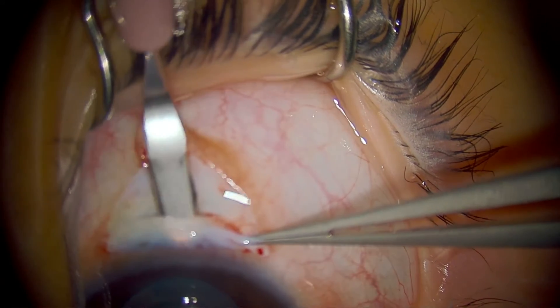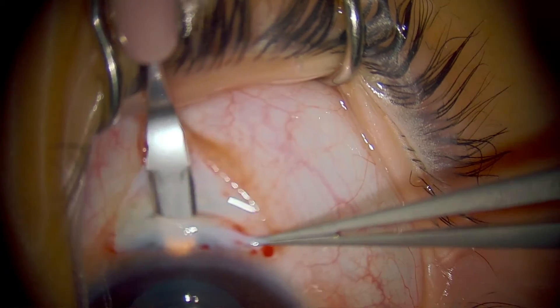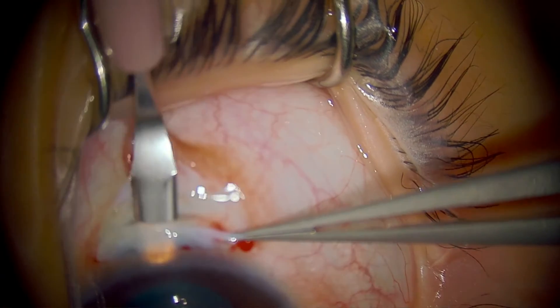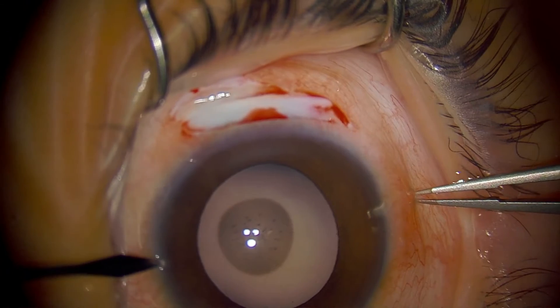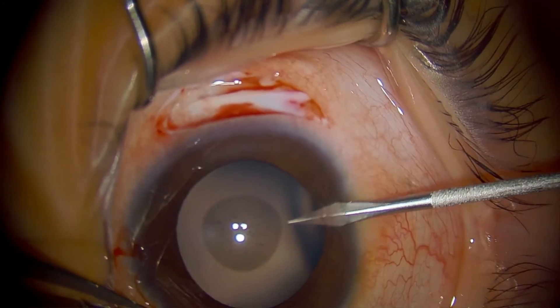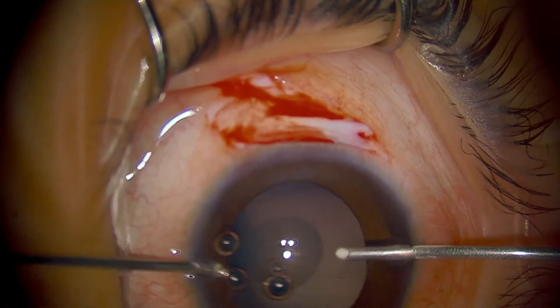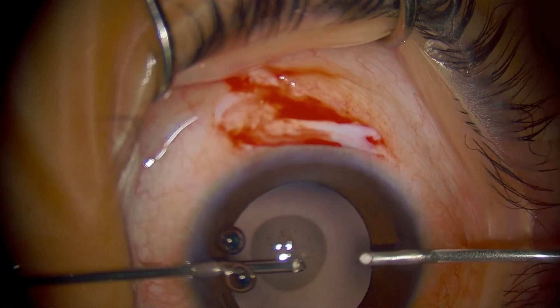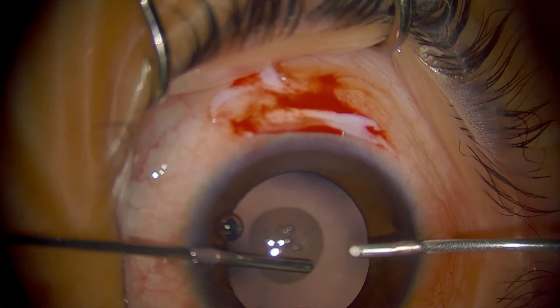Either case, we're going to remove the cataract first. The way I like to do cataract surgery is to do a scleral incision for my lens implant. The next part of the surgery is really just for the lensectomy part — whether you're putting in a lens or not, this is the same way we would do it. We're going to use a vitrectomy style of lens removal, mostly vitrectomy and aspiration irrigation.